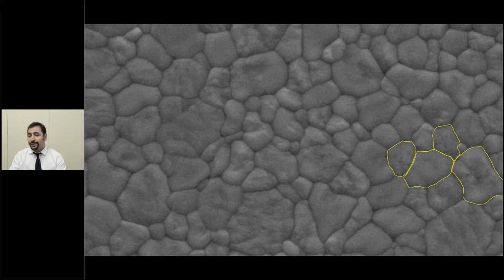These are the grains that you can see, they're packed next to each other, and the boundary between them is called the grain boundary. It is very important for us in terms of optical properties. Now imagine in this zirconia a crack happens. Essentially, zirconia has this so-called self-healing property that is able to not let this crack propagate further.